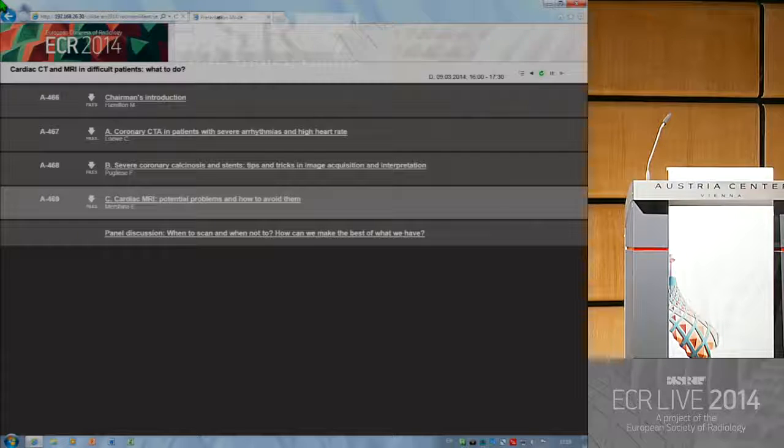My perspective is that CT is very sensitive and not specific for dissection. We overcall them, and we overcall them when we misinterpret pulsation artifact. And now we can do ECG gated studies of the thorax at lower dose than helical scanning anyway. So we should just get on and do ECG gated studies and make our life easy. Do people here agree with that idea, or would anybody like to offer an opinion on that?